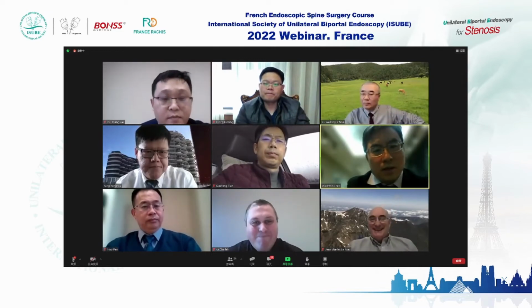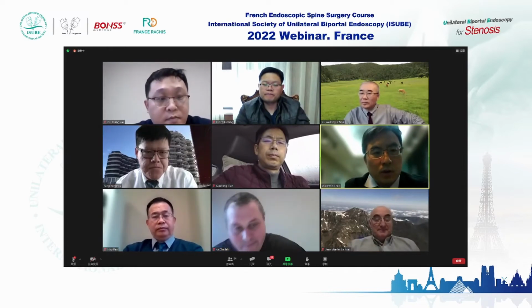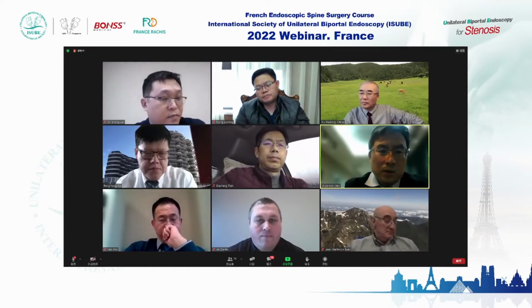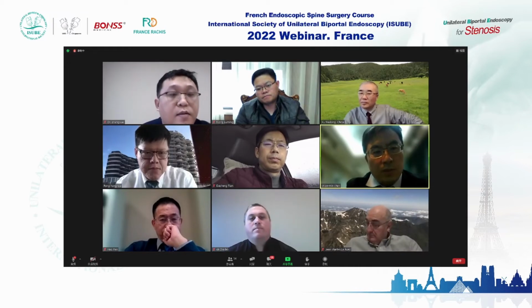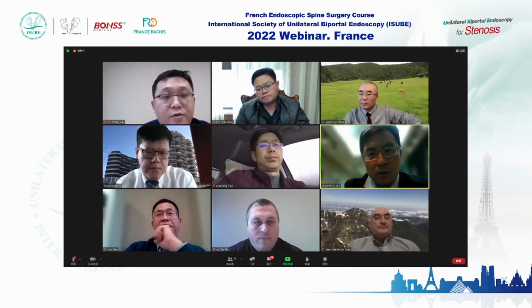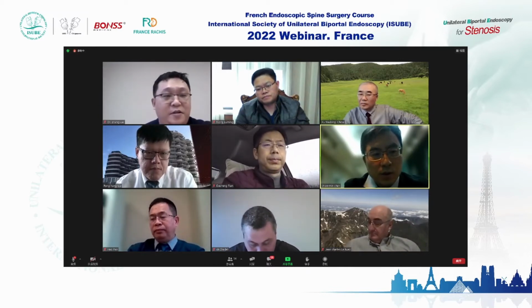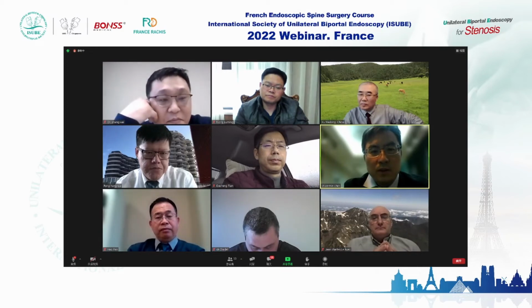I think I have a paper published comparing uniportal, biportal, and the microscope for lumbar spine surgery. But in the cervical spine, it's different from the lumbar spine because there is a spinal cord problem. So in this technique, maybe it's a no-touch technique. Maybe you cannot manipulate the spinal cord, or you can only slightly touch the spinal cord. If I compare a microscope and the endoscope, the endoscope has the water pressure problem. This is the first problem.